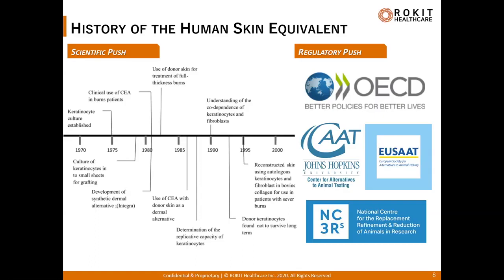Although 2D culture of this type was simple and reproducible, the relevance of 3D constructs became more and more evident in the late 1970s, as a living skin equivalent that implemented a dermis-like structure within collagen hydrogel. Further technical advances in the 80s and 90s, specifically the technology of electrospinning, led to the use of scaffolds. And at present, the implementation of 3D printing for use in biological applications is proposing new ideas to replace the hand-poured hydrogel matrix or fine meshes created by polymer solutions, setting a new standard for the production of architecturally more complex 3D tissue constructs.